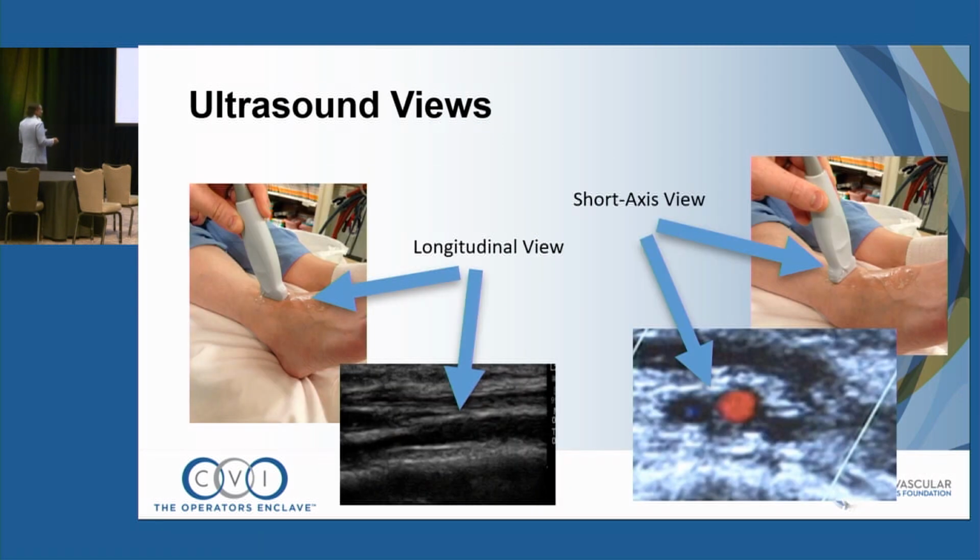It's good to learn how to do longitudinal, and this is just one of those things, just play with it. Good to learn longitudinal as well as short axis. I usually get access in short axis, but sometimes it's nice to see the wire traverse in long axis.